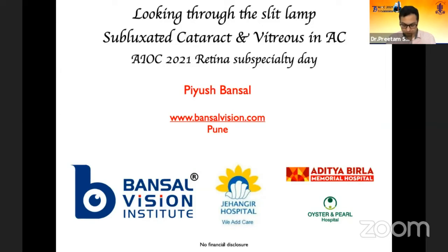I'll be talking about when you're looking through the slit lamp, what do you look for in a subluxated lens? How do you identify subluxated cataract and vitreous in the anterior chamber?